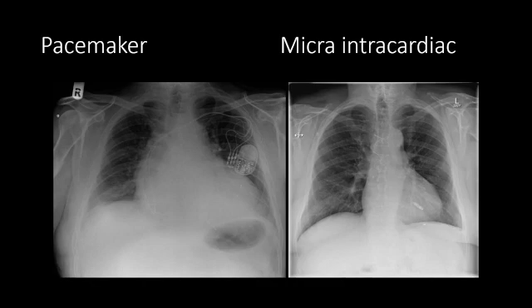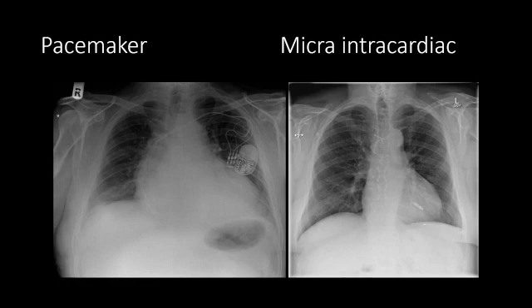The most typical cardiac pacemakers you will see can be single chamber, dual chamber, or biventricular pacemakers. This first image shows a biventricular pacemaker, which has a right atrial appendage lead, a right ventricular lead just like a dual chamber, and a third lead run along the coronary sinus towards the cardiac apex.